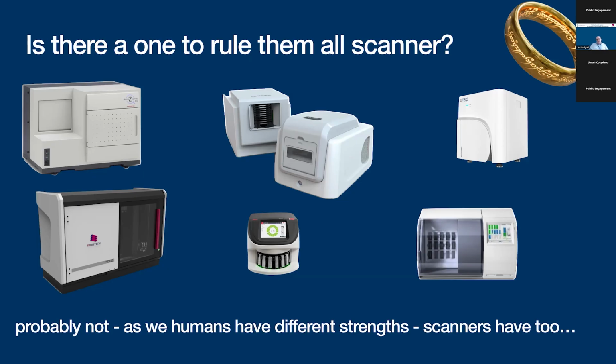And on the top middle, you can see the Glissando scanner, which many people dismiss for what it is, an older scanning technology with a big frame into which you can put two normal slides or one big slide. But it has lately become my all-time favorite for dealing with difficult slides. Can you imagine? You can put in a broken slide and you can still scan it with this scanner. Or you can do the scans which the automated scanners are unable to do by manually adjusting all of the focus points. It saved the bacon many times.